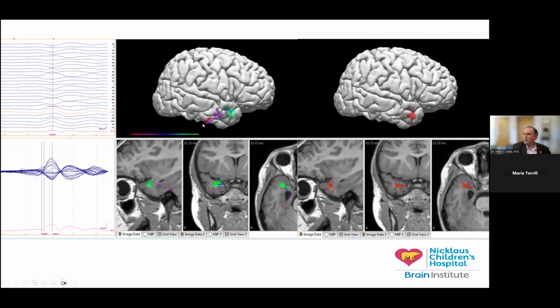The rotating dipole, on the other hand, is saying, you know what, I just want to fix the location at one spot, find the best spot that accounts for this short time interval, but allow it to rotate and orient and increase in strength throughout there. So these are two ways of looking at it. And if you take a look at a rotating dipole and it's just spinning every which way, you're going to say there's probably a propagation effect in there, and that should be simulated also by the moving dipole. So we looked at both of these in that study that I mentioned before, and again, considering both of them helped us to understand and to do well and have a high sensitivity and specificity when we looked retrospectively at our data.